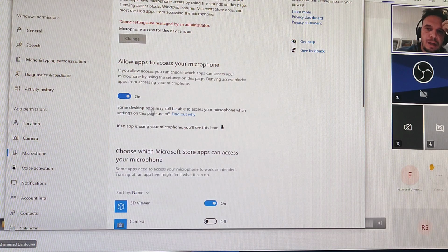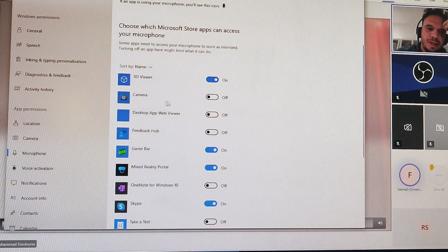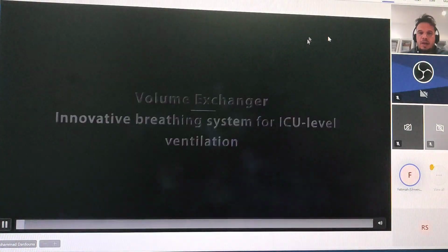Sorry, I will solve the sound problem later, but you can see the video to see the operation principle of this. You explain while the video is playing. Okay.